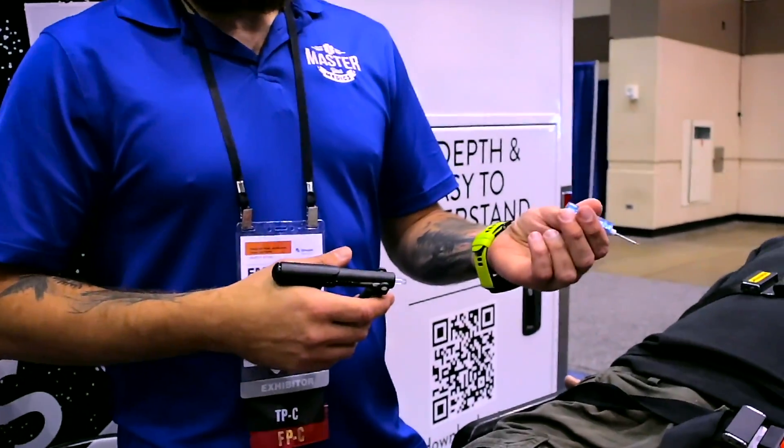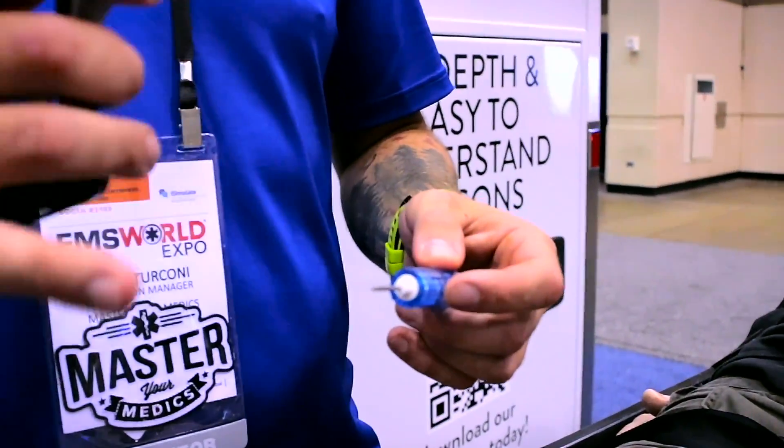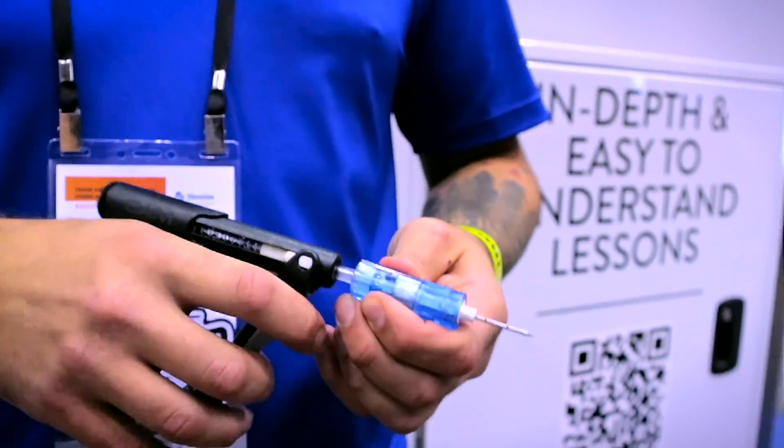There are different needle sizes: the longest one is the yellow, which is also the bariatric needle; then there is the blue, which is the middle size; and the red is the shorter size.